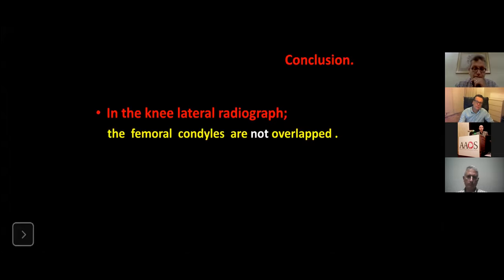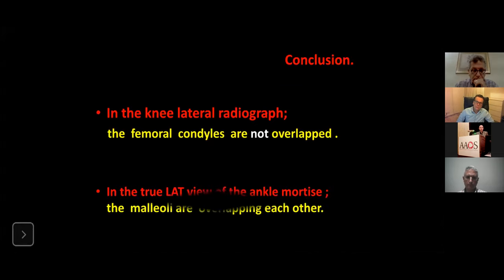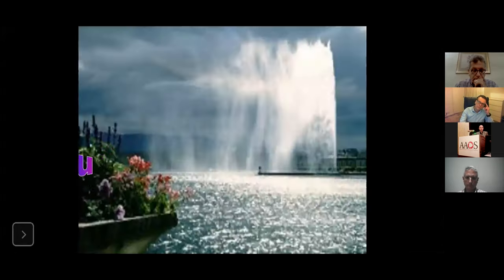For the knee lateral radiograph, femoral condyles are not overlapped. In the true lateral view of the ankle, the malleoli should be overlapping.